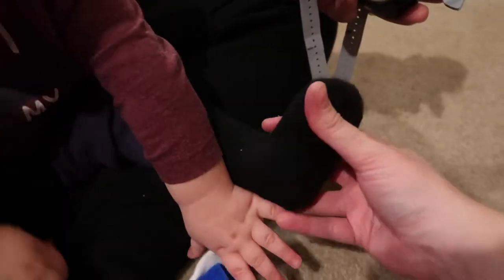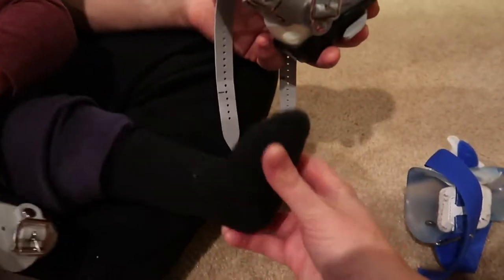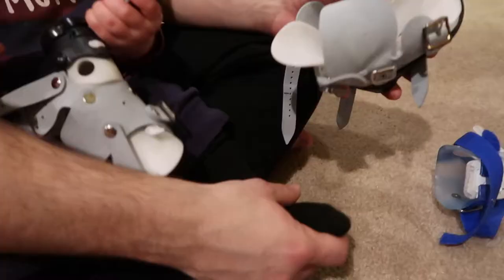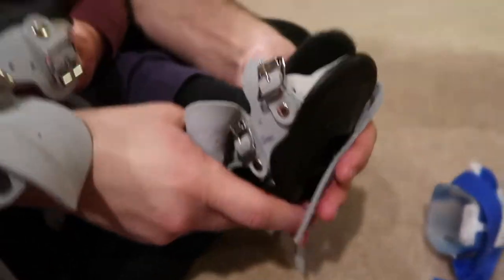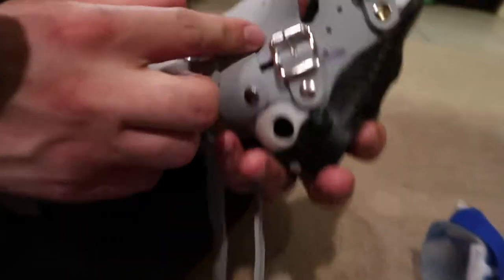We were going to stretch his feet, and so for us that's what we had to do before we put it in. But obviously do whatever your doctors have asked you to do before you put his foot in the boot. We kind of stretch it and then slide it in, making sure through this hole that his heel is completely at the back.